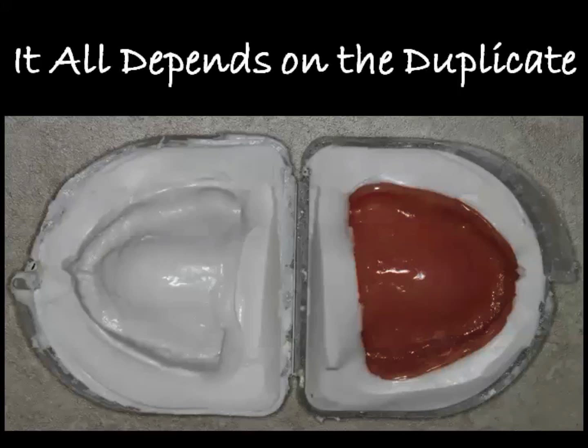Hi, this is Dr. Corey Glenn and I want to show you what I believe to be a new and improved way of doing full arch cases in Blue Sky Plan.